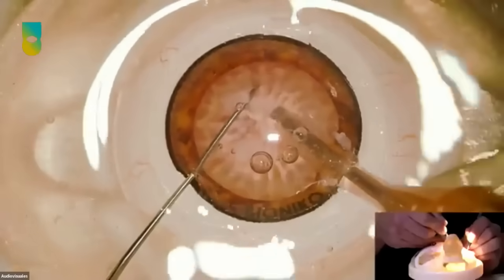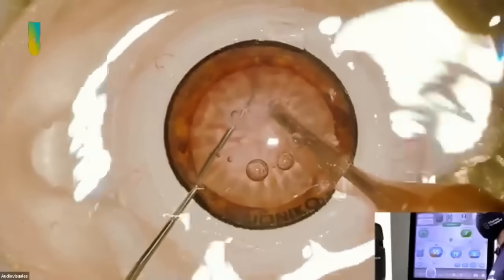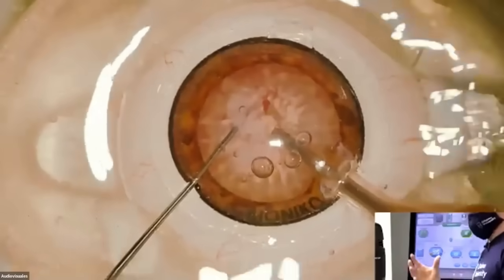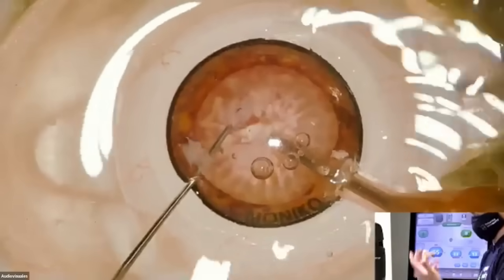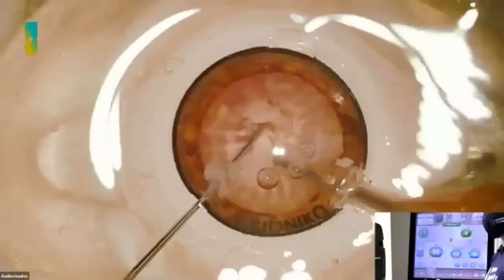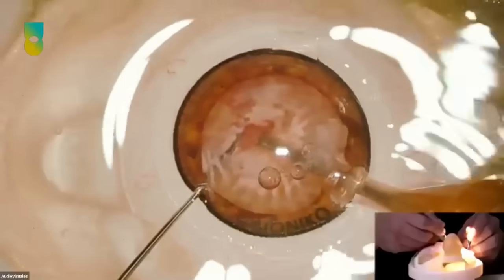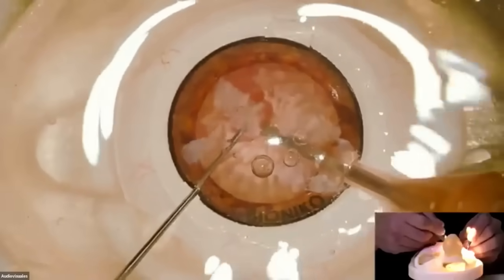Look at that. He's listening to the machine. The machine is talking to him. He's saying, you know, they have some occlusion. You can hear the pump rising, the vacuum. So imagine if you are able to do 50, 60, 70 cases, and you understand how the machine works. You know how the pedal is going to behave. Look, he has some fragments there, but he's scouting. So what's happening, Pablo?